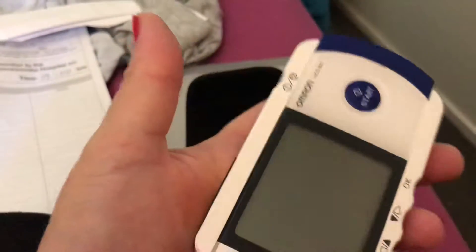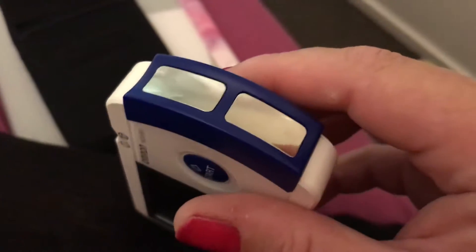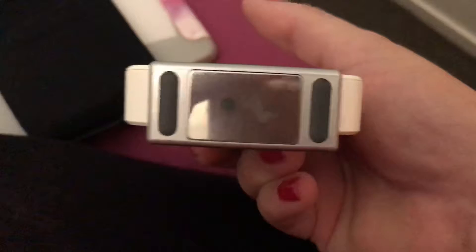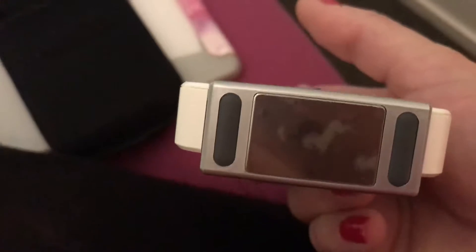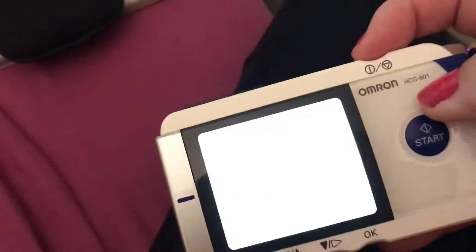I've actually got to turn it on when I get pain, which I'm actually sort of starting to get now. So I'm going to show everyone what I'm going to do. I've got to put my hand on it, turn it on, and push that electrode — the shiny silver thing that you can see — against the skin.